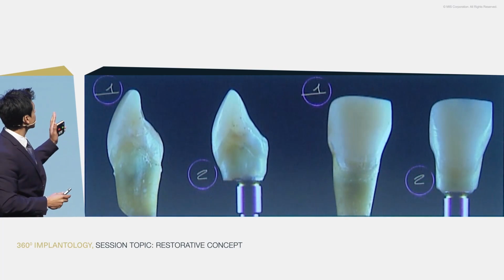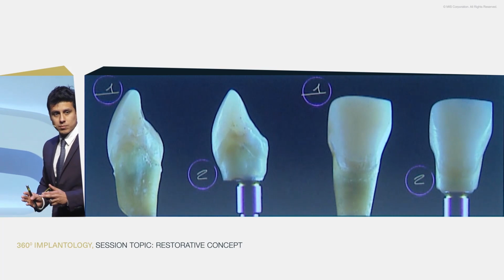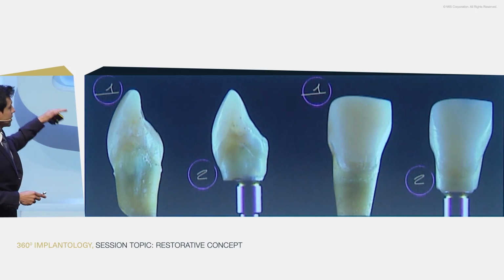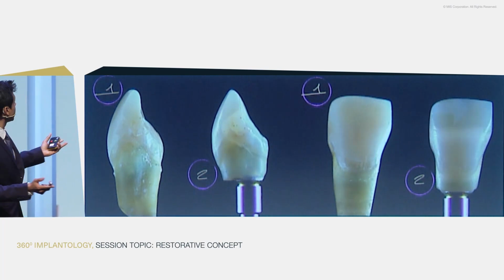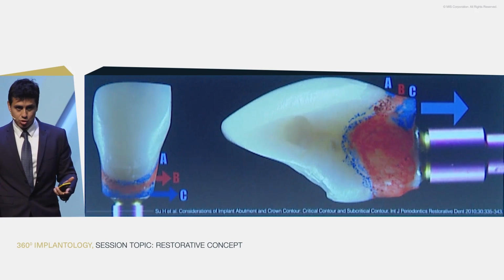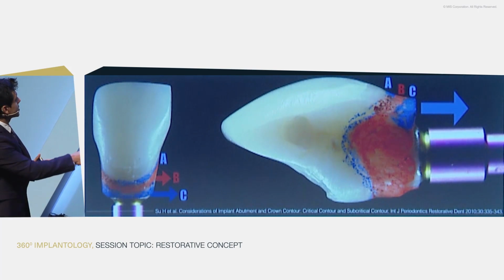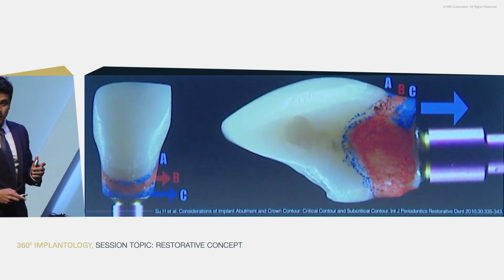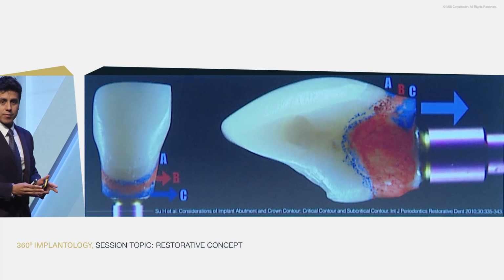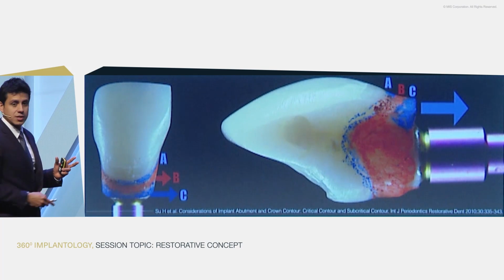And now you can see we have figure number 1 and figure number 2. If you compare, number 2 is the same tooth, but with the provisional abutment on top. And now we have to understand where we can manage the tissue. If you see, line A is the gingival level. Line B is 1 millimeter below the gingival level. And we have to work just in the letter C.